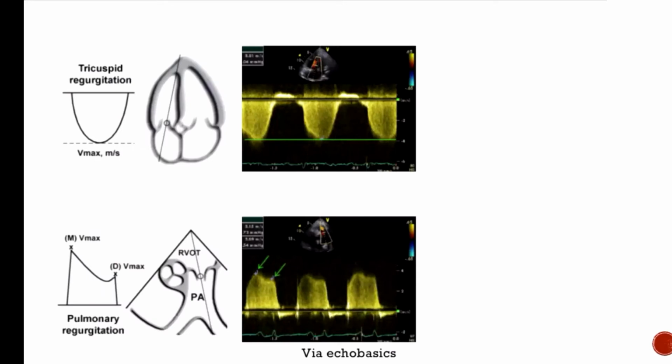All right. So let's move on to a couple hemodynamic parameters that you guys can use in your practice. In 2 weeks, we're going to evaluate hemodynamics in general. So we're going to go over Doppler in a deep dive. So I want you this week to just accept that these Doppler assessments are reality and recognize the equations that you're going to use over and over again. And then we'll dissect this equation next week so you understand what goes into each part of the equation.